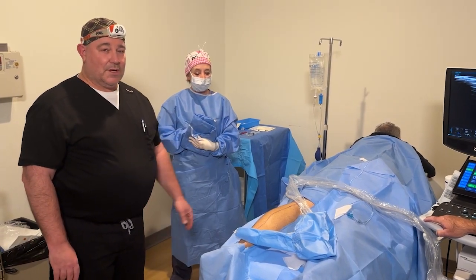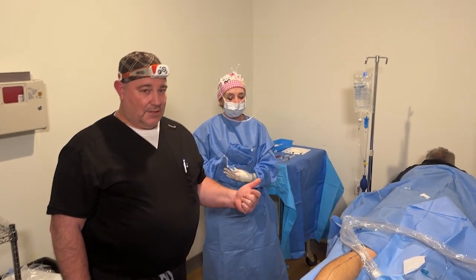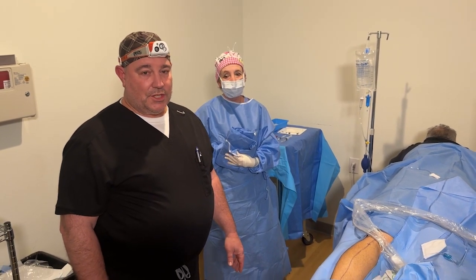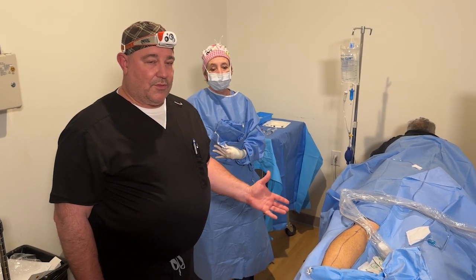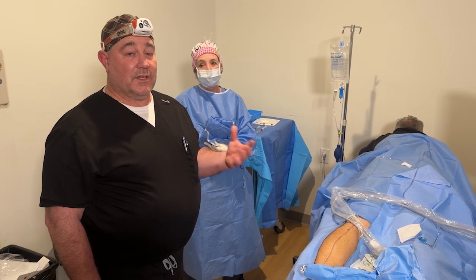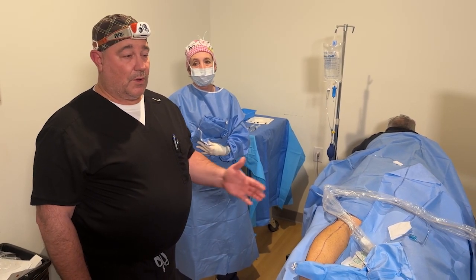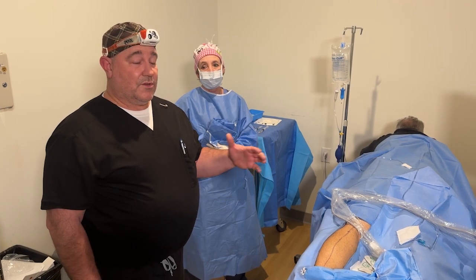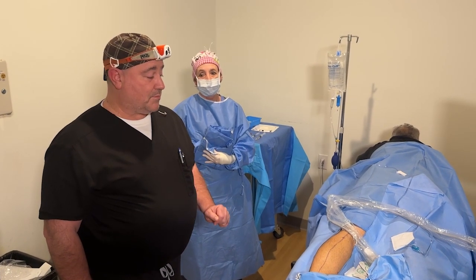Our patient here came to us with complaints of aching, swelling, cramping, and burning and itching, and has been worked up thoroughly. He showed significant reflux in his small saphenous along with the great saphenous veins, which have already been treated, and now we're on his last procedure.